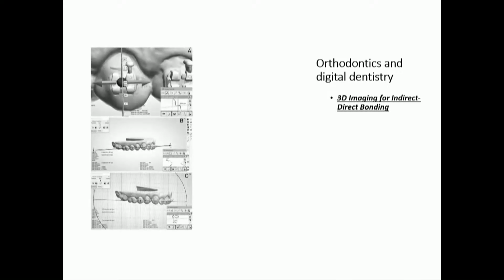And enough about me, enough about what I do. We can use it in different aspects of dentistry. We can use it in orthodontics, in indirect bonding, for example, where you can just scan and send it to the lab, and the lab can tell you where to bond your metal brackets. I know that orthodontists are probably among the dentists who use digital dentistry most on a daily basis, but this is another way where it's mixed between conventional orthodontics and digital orthodontics.